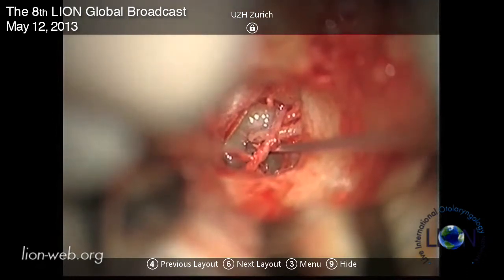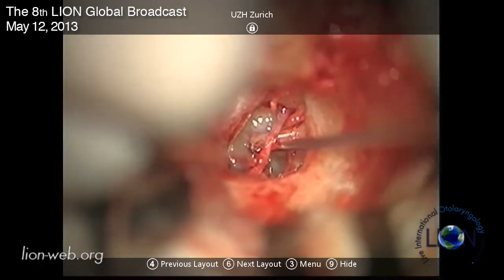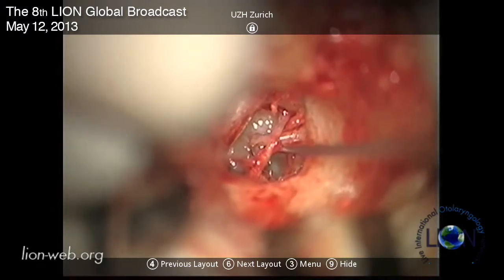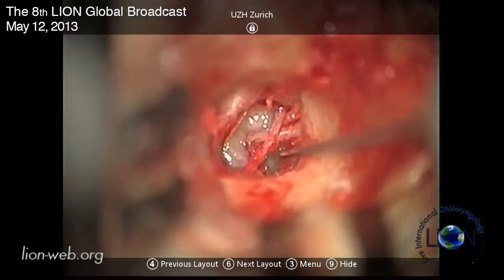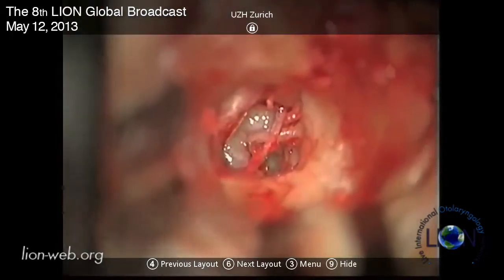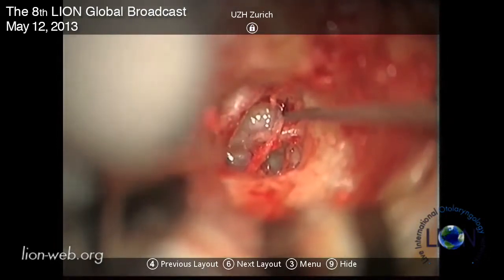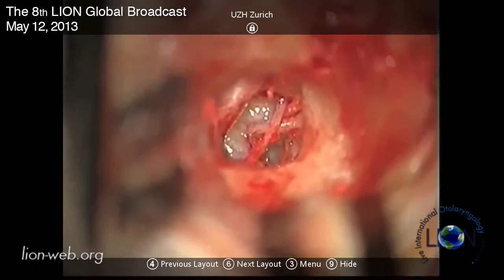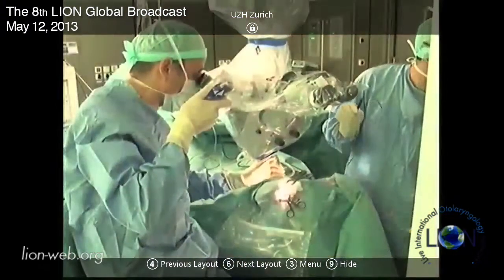Of course we have to be very careful not to move the incus too much. The incus moves nicely - also the malleus. Good. And then what I always do is I cut the tendon and the crus using the laser.